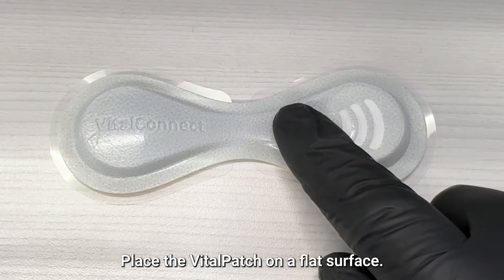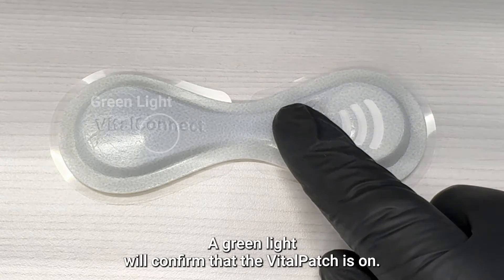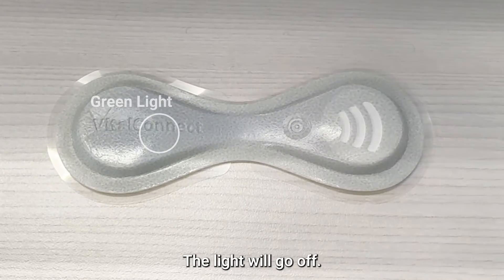Place the Vitalpatch on a flat surface and press the power button. A green light will confirm that the Vitalpatch is on, and then the light will go off.